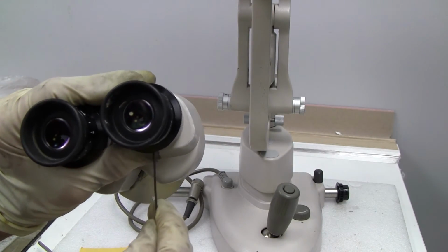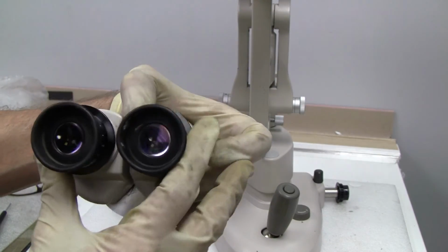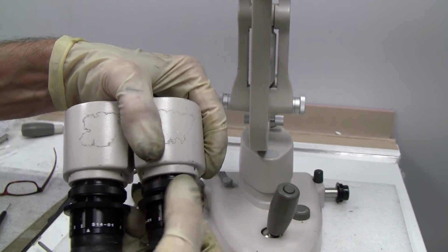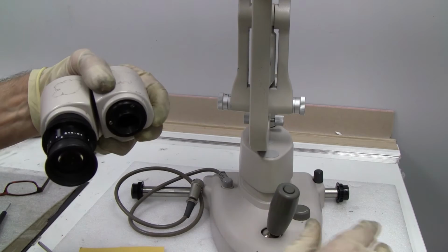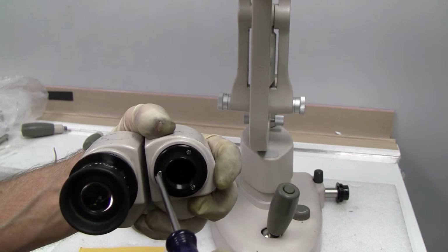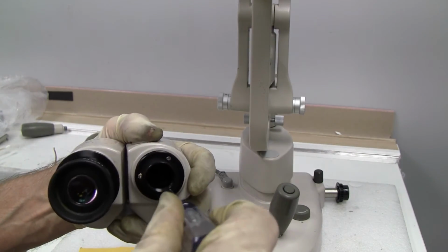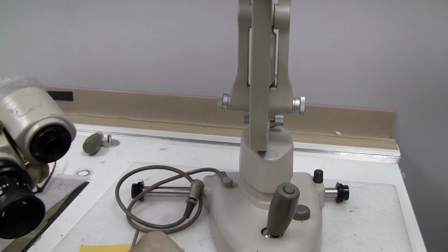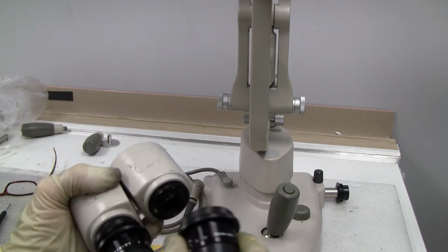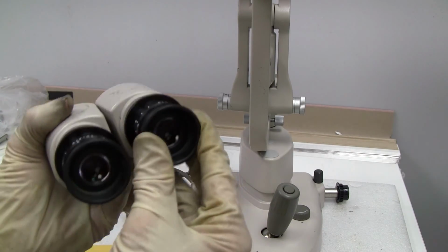Once you have them all snug, if it's snug and the light is centered, take your eyepiece back off, and then tighten your Phillips back up. So make sure these are good and snug, your Allens, your 3 Allens, your Phillips. Put it back in and check it and see if your light is still where it was. You may have to do it more than one time.